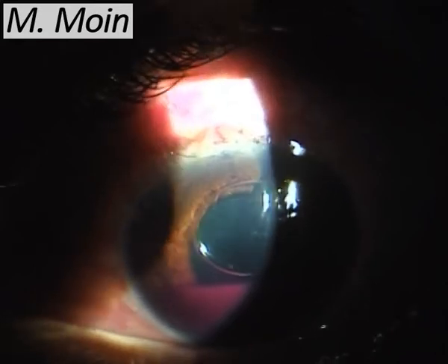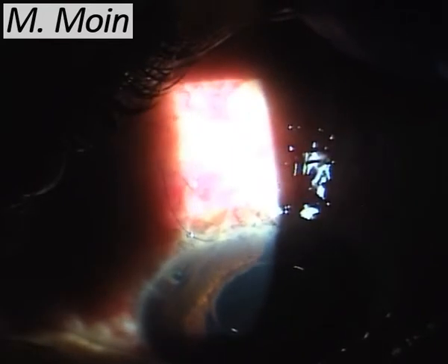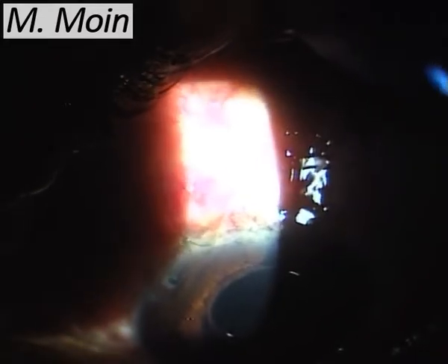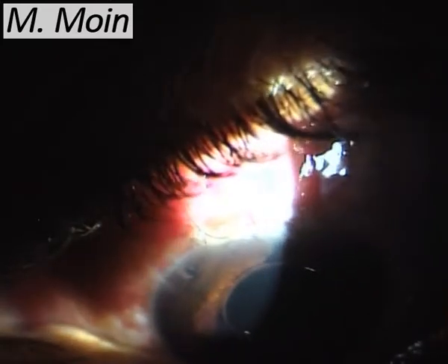So this is the video of the patient showing you post-examination findings. This is a patient with a narrow angle. So this is a YAG iridotomy which is present over here. This is a conjunctival suture which was present over here. Let's go forward on this. So this is the slit lamp. You ask the patient to look down and you check for the bleb.